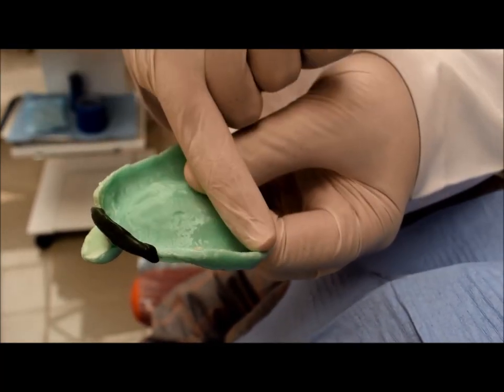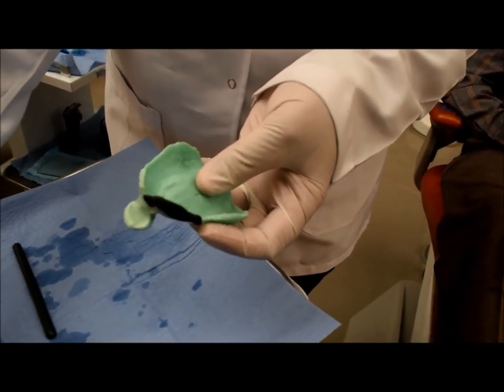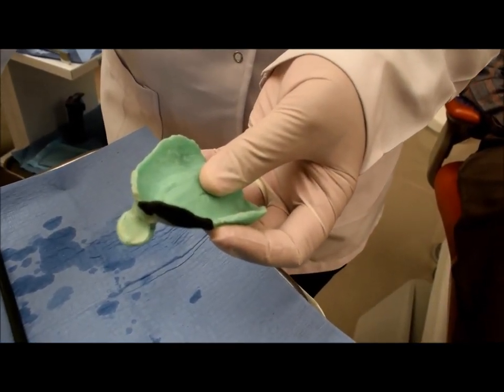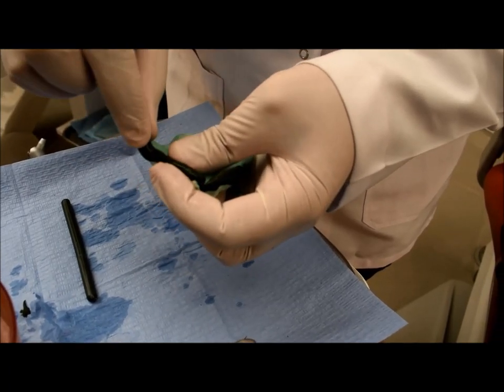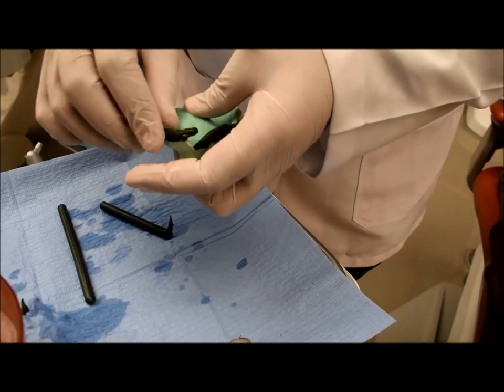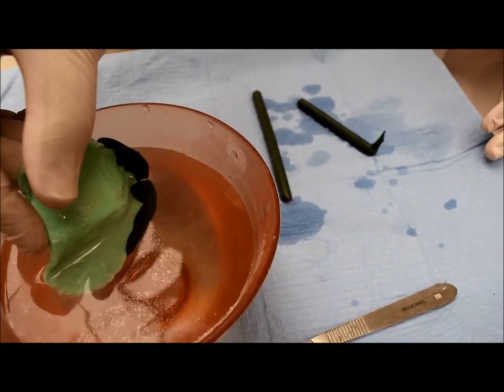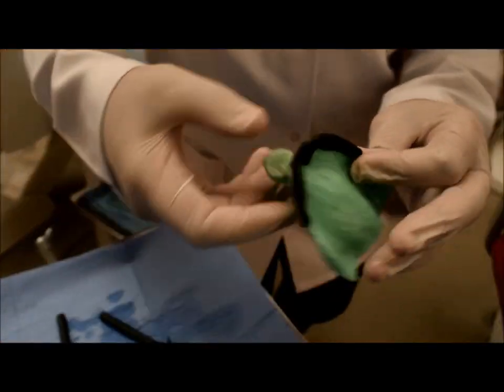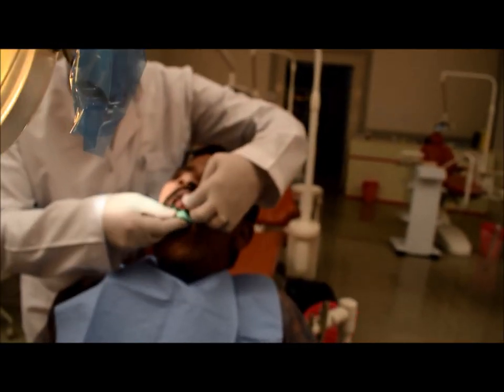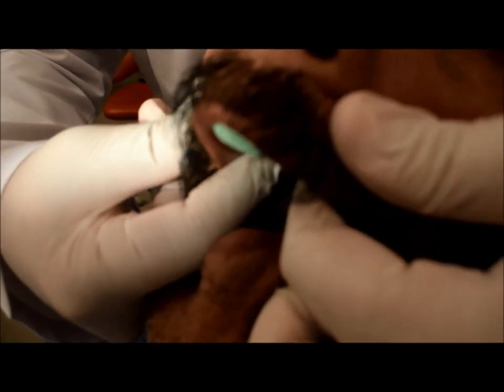After finishing the first part, I will go for the second section. I will now show the technique using hot water. I insert the green stick into the water — never throwing the compound inside the rubber bowl, I have to hold it outside. I apply the same technique as with the torch, inserting just the green stick to soften it. I check that it is soft, go behind the patient, rotate the tray, insert it, and perform border molding — downward and inward, the same technique, molding slowly.